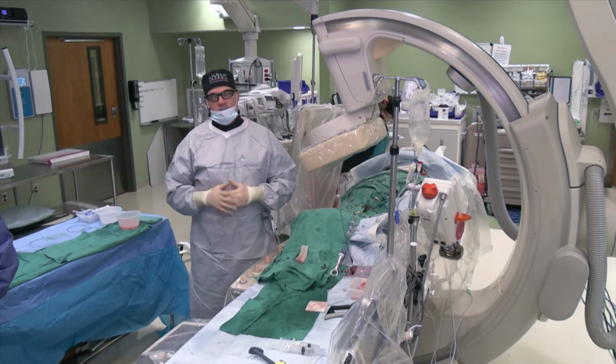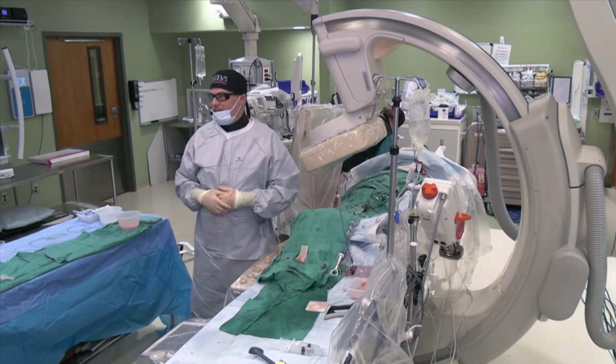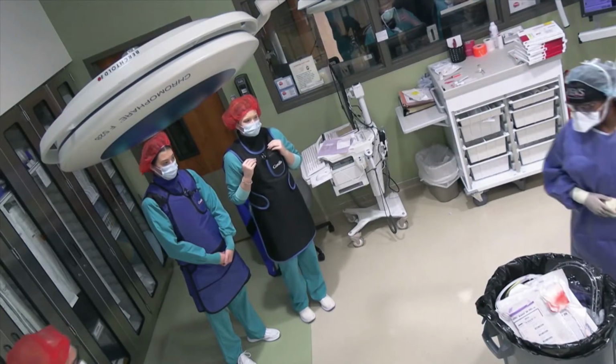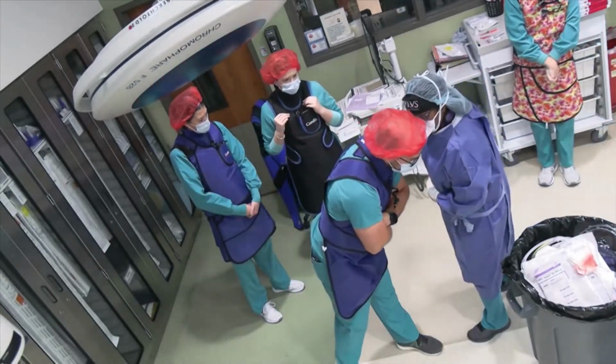We're broadcasting from North Carolina. I've got Alexis in the room with me, Tina beside me, Justin on the panel outside. But regardless, let me go ahead and take you through this case.